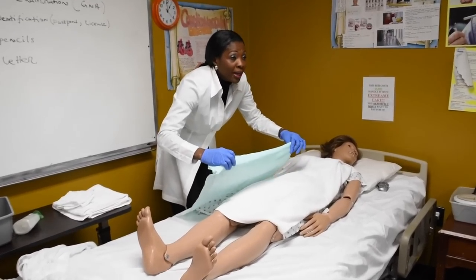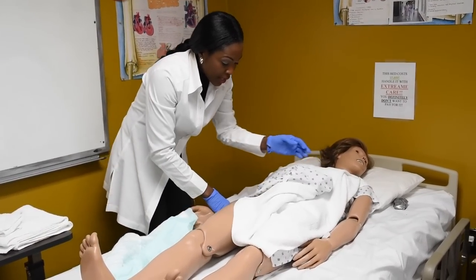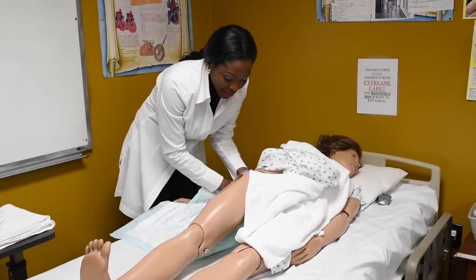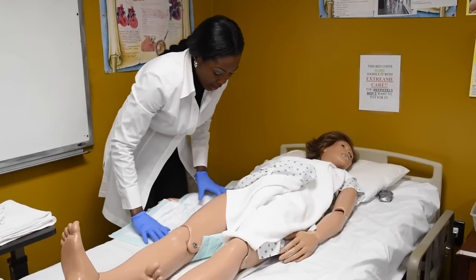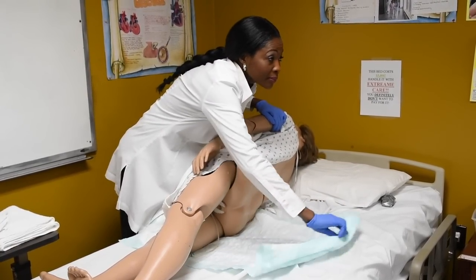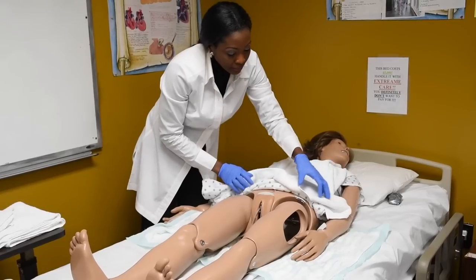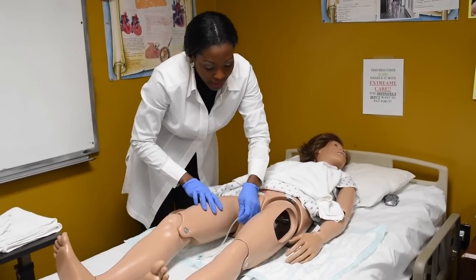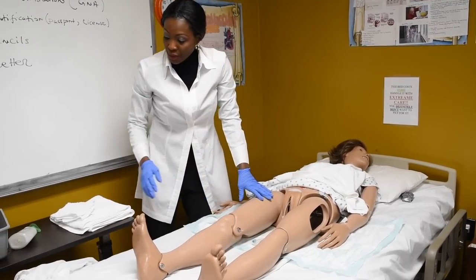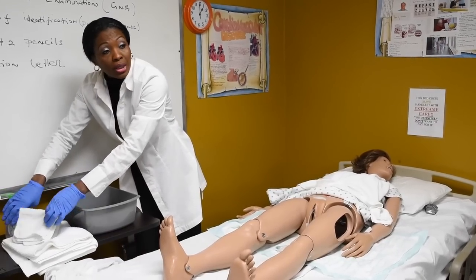Put in a chuck under a patient, you fold it into half, okay? So that by the time it gets to the other side, half of your pad will be there and half will be towards you. Same thing, except now, I'm gonna be washing the catheter, okay? That's what you are being tested on for this scale, and it has a critical element.